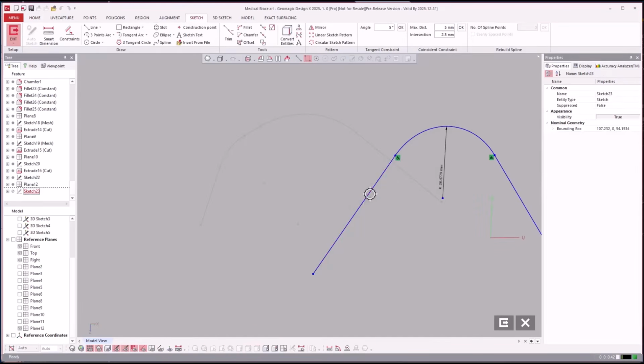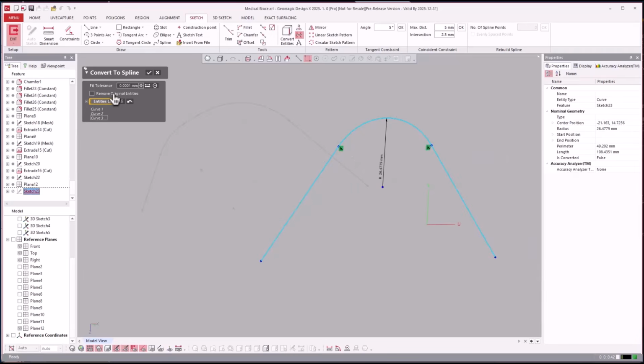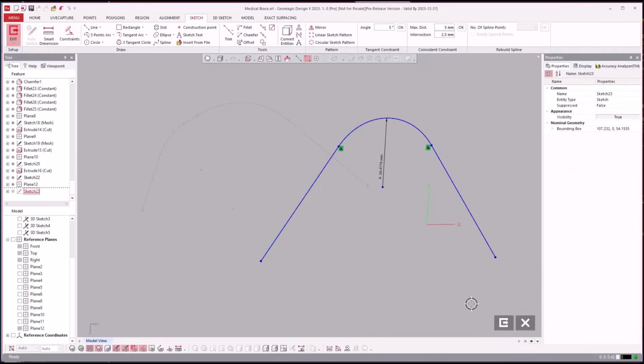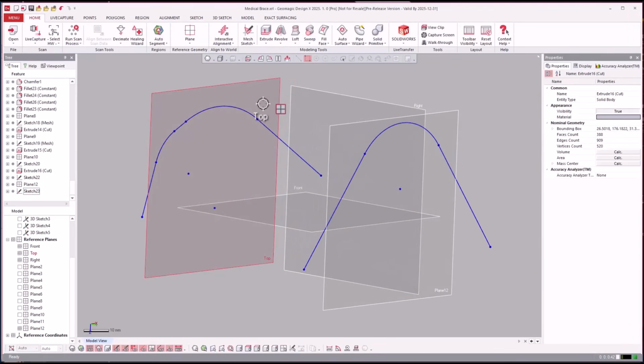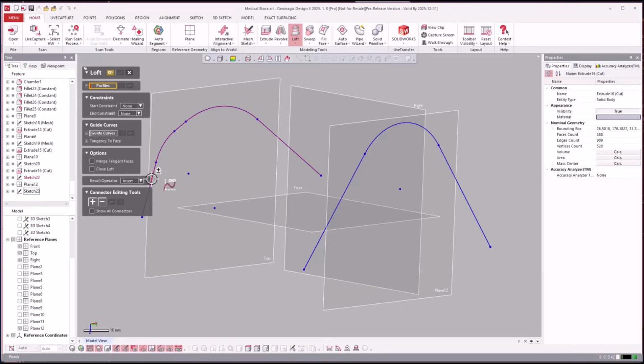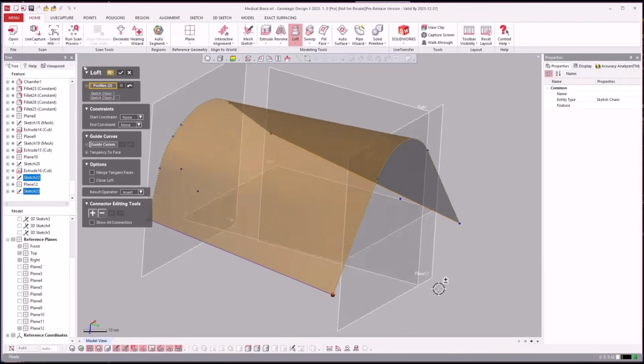Now we'll come over to this, do the same thing. And you can also select remove original entities. So what we're going to do is we're going to fit a spline over top of it, but yet keep that. So it's going to be a spline and line arcs in there. Now, when I go to loft, I can roll over the spline and roll over the spline. And you see I get a nice clean loft.